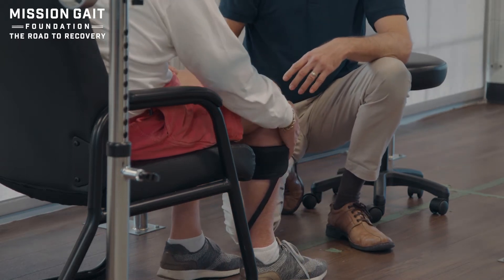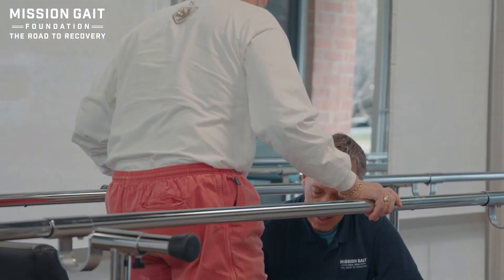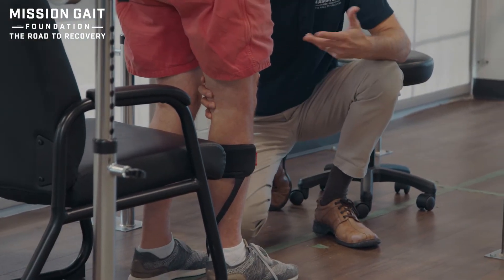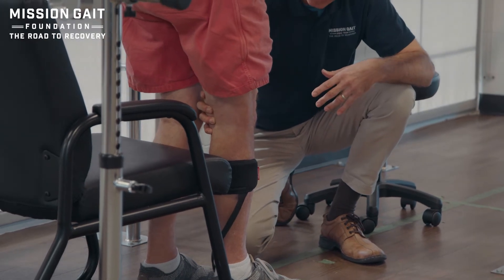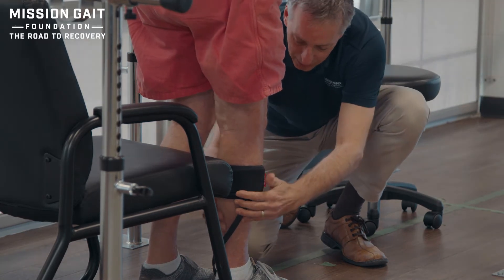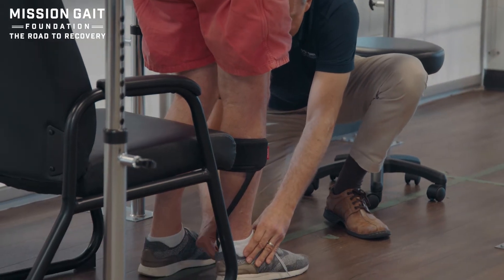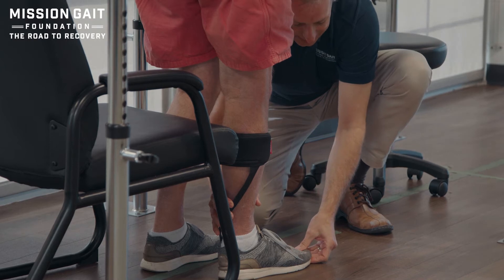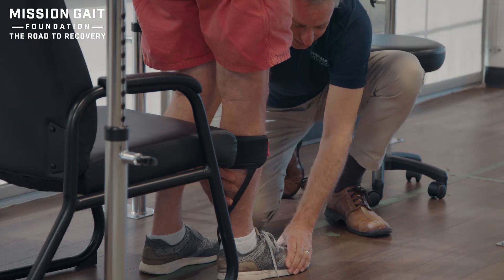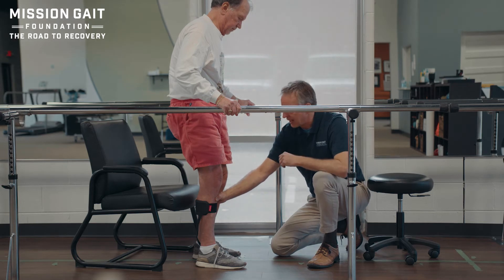At this point I'm going to have the patient stand up. Go ahead and keep your hands on the parallel bars and stand up. Step forward just a touch. Keep a soft knee - not hyperextending, but also not bending. Just keep it in a position just slightly short of fully straight and put all your weight right on it. I want to look: are there pressure areas, anything where I can see it could put a mark on his skin? I also want to check my length - the length looks good. He has plenty of extra shoe. No pressure areas - I know I have a pretty good fit.